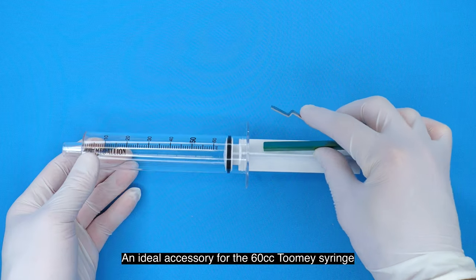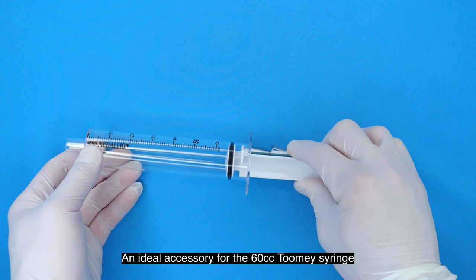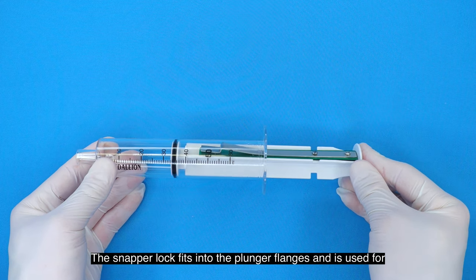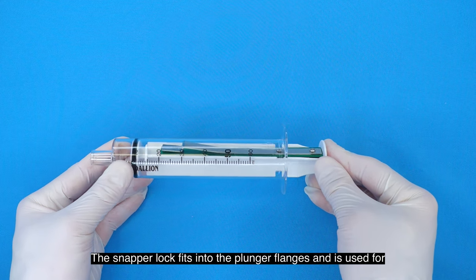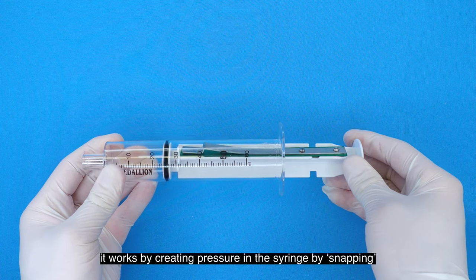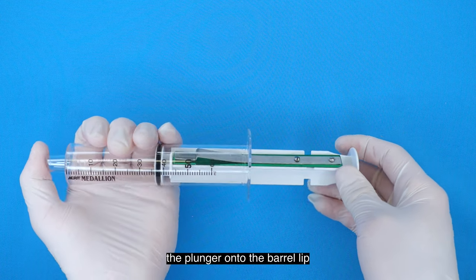An ideal accessory for the 60cc Toomey syringe is the 60cc snapper lock. The snapper lock fits into the plunger flanges and is used for easy fluid extraction. It works by creating pressure in the syringe by snapping the plunger onto the barrel lip.